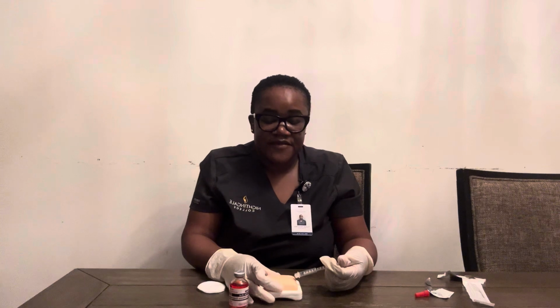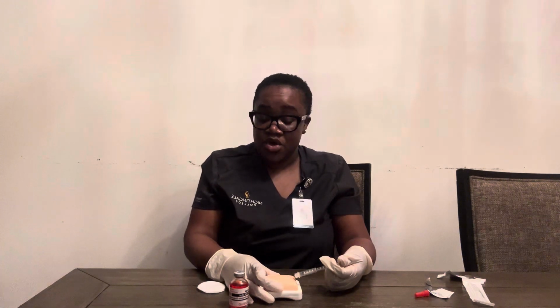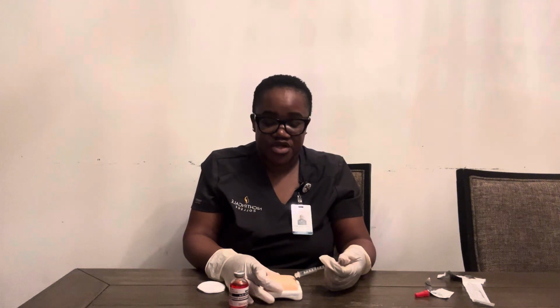Okay, so when I do this, I should encounter a bit of resistance. If I'm not encountering any resistance, it means I'm too deep under the skin and I need to restart my procedure.